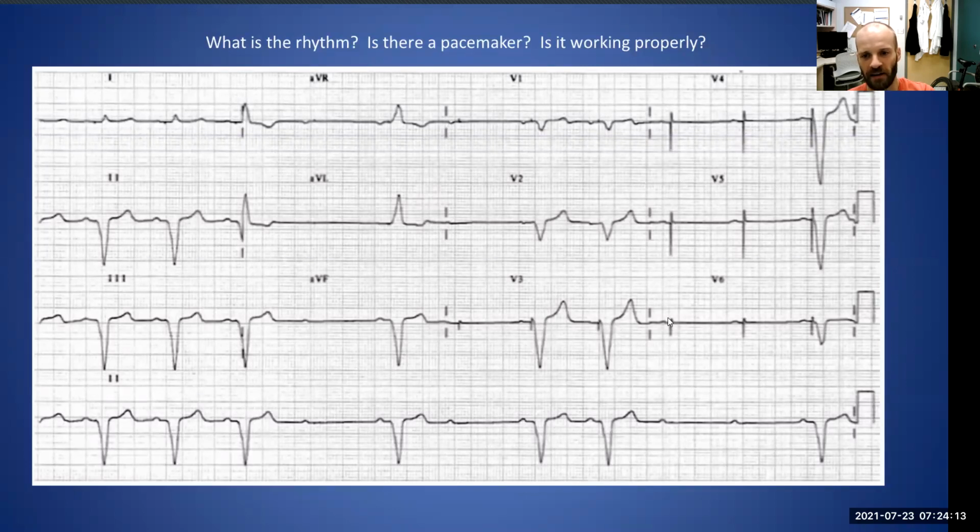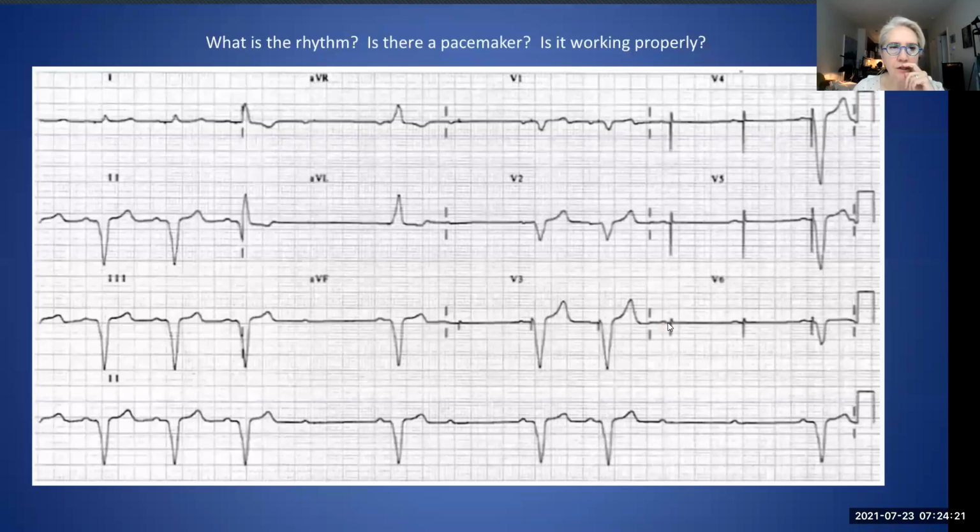This is ventricular pacing, and the ventricular pacemaker isn't working all the time. So very good effort. Well done. Charlie, can I ask a question?